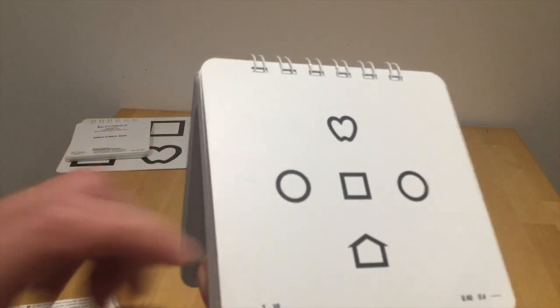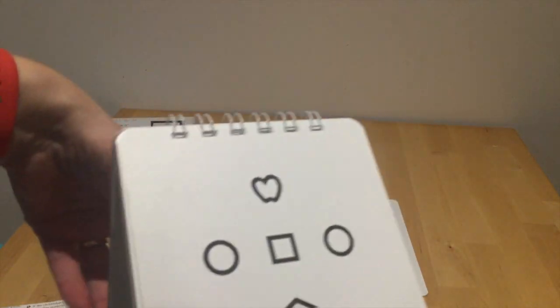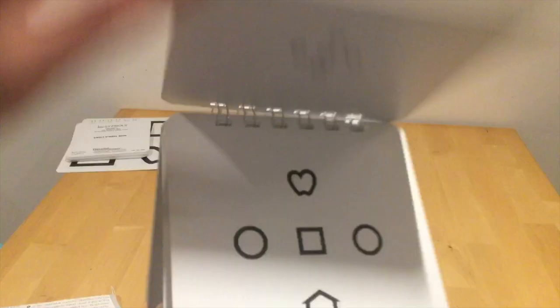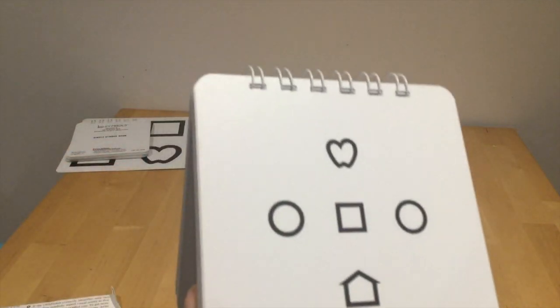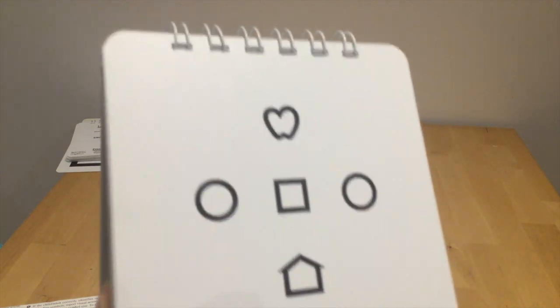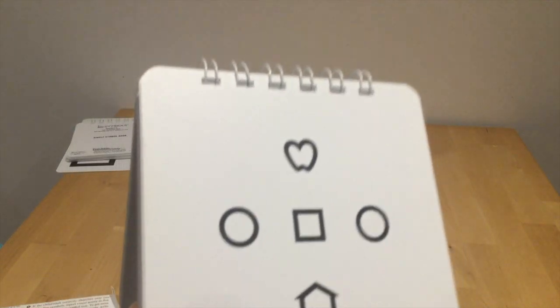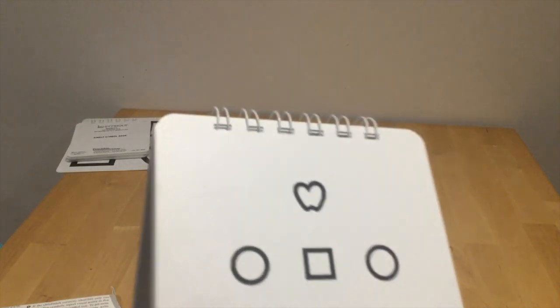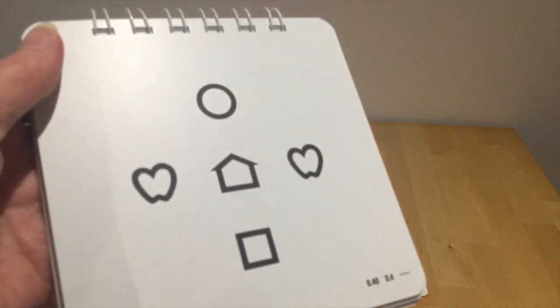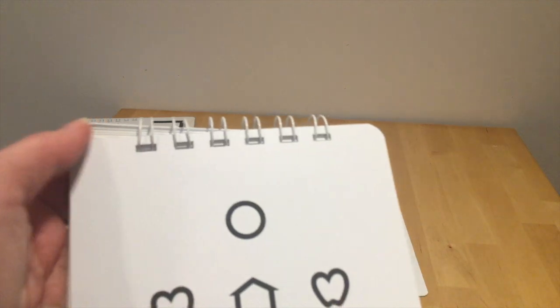Circle. And if they get 3 out of 4, sorry, when you go back, it's not just the one on the outside. You want the heart and the circle. And you want the circle and the square. So they need to get 3 out of 4 correct. And what you're looking for is the middle symbol to be correct 3 out of 4 times. And then you can move on. So it's quite precise. There are some very good instructions with it.